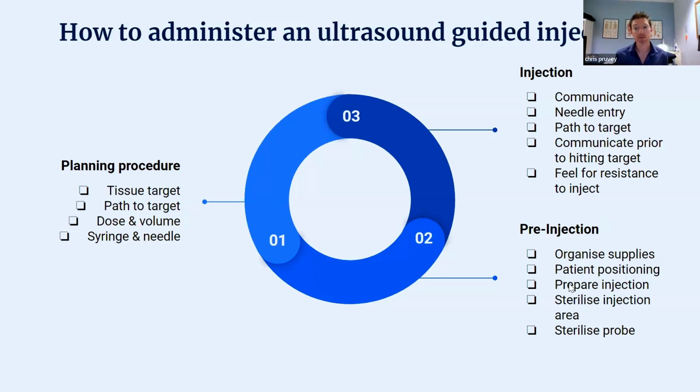And so we sterilize the ultrasound probe. We can do that just with some Clinell generally, and we sterilize the patient with some little chlorhexidine wipes, and we use this, which is just sterile ultrasound gel. So this is just the ultrasound gel we normally use, so it's all clean. So I've cleaned the area which is going to have the needle entry. I'll put sterile gel on that. And I've also cleaned this, and that's important.